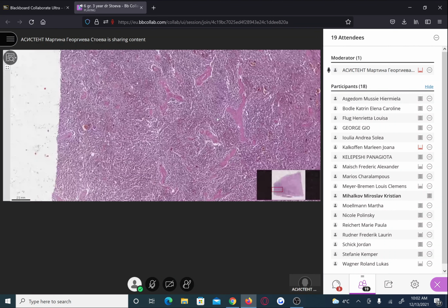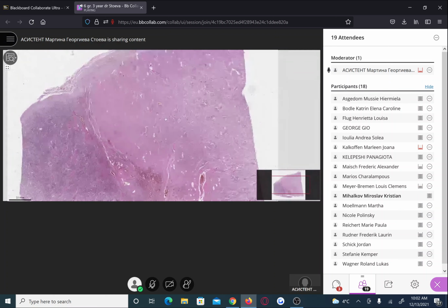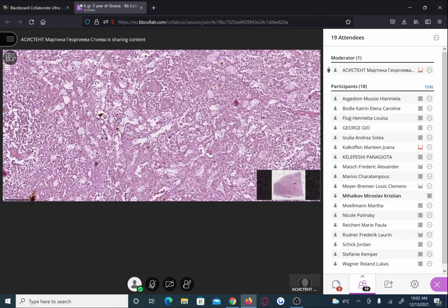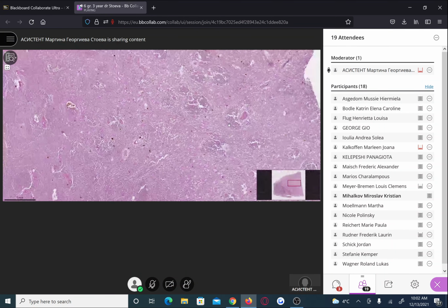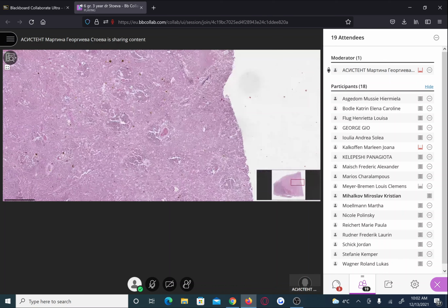And then we concentrate on the appearance of the infarcted area. It is paler at low magnification because of the absent nuclei of most of the cells, and their cytoplasm is hyper-eosinophilic. But note that there are still shadows of normal structures like lymph follicles with centrally placed arterioles.